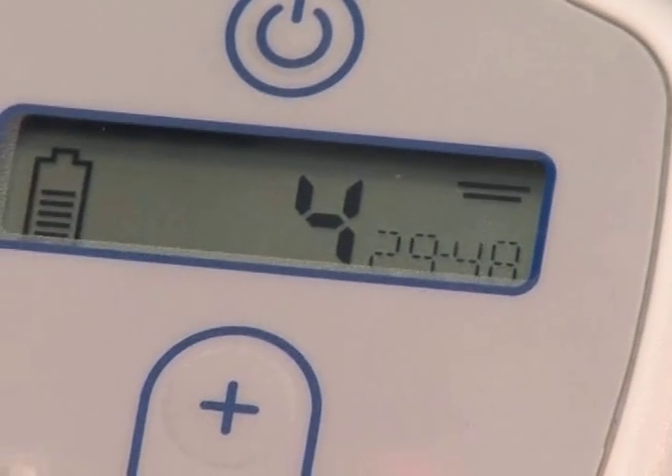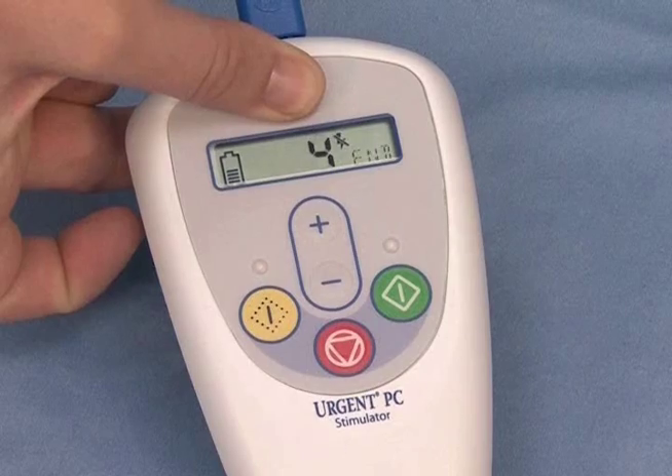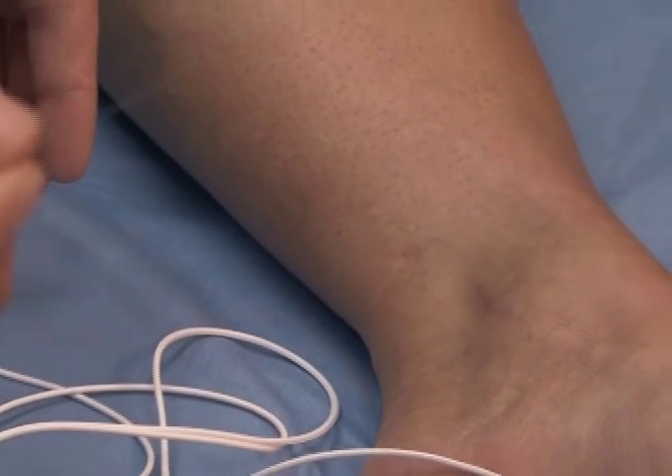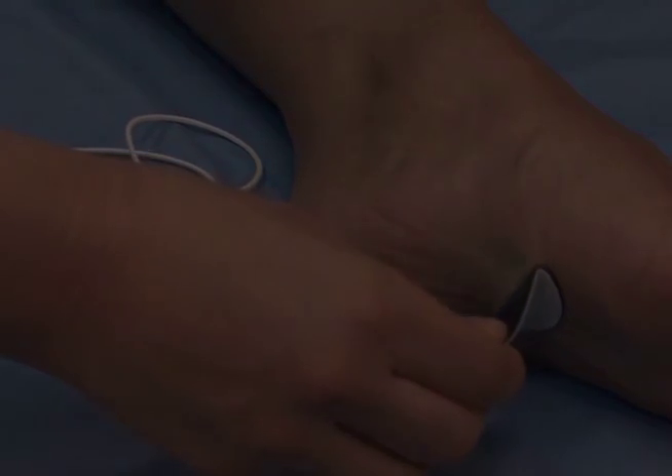The patient sits comfortably for 30 minutes during their treatment session. At the end of the treatment, the clinician will turn off the stimulator and remove the needle electrode. The patient is then free to resume normal activities.